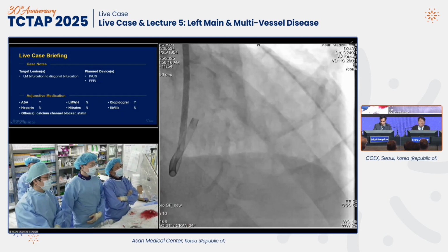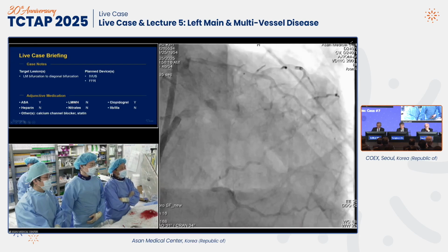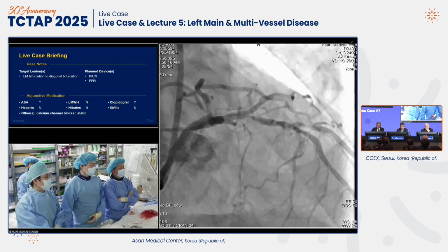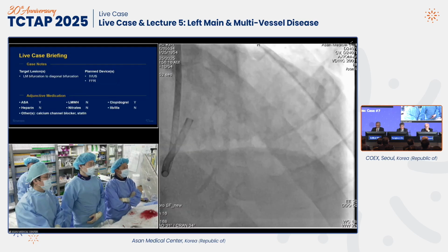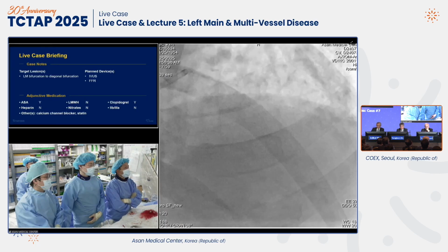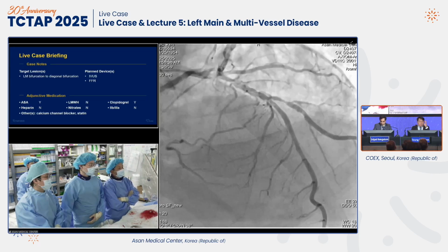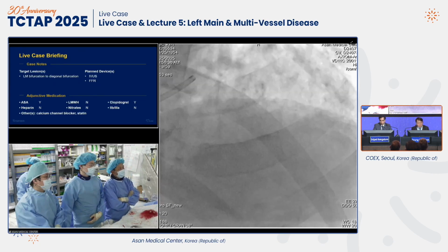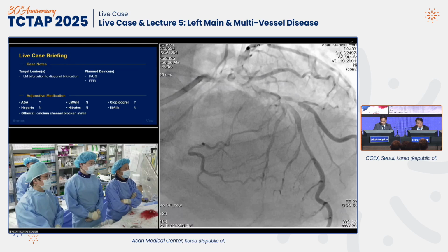This is a cranial view. You can see diffuse severe stenosis of the LAD, and it looks like there is collateral flow to the far distal PL branch. Considering the relatively small circumflex size, it would feed the distal circumflex or distal OM area. And this is the unmagnified image of the proximal cranial view. You can see the diffusely diseased LAD, and the diagonal has some intermediate disease.